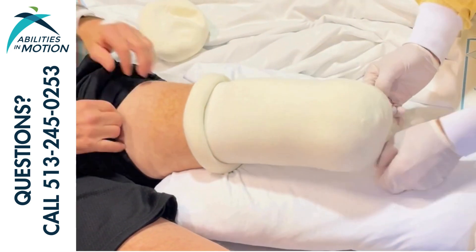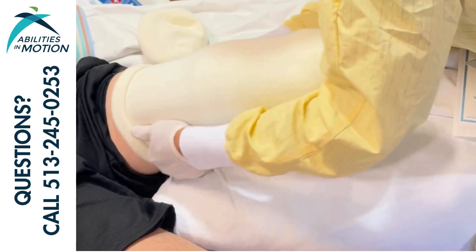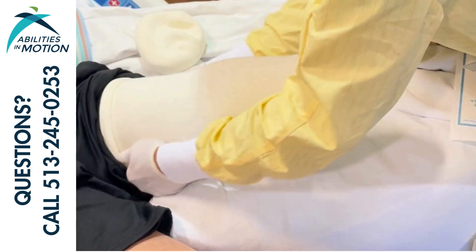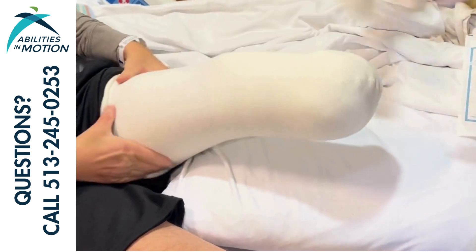This also tends to be a little less painful for the patient. Make sure that you're pulling the socks up as high on the thigh as they can go to protect that skin up there and prevent them from getting caught in the body of the cast.